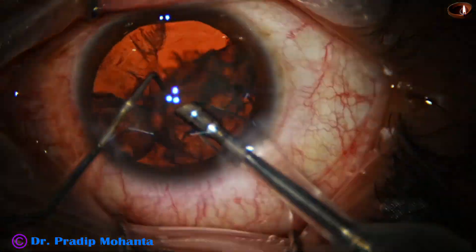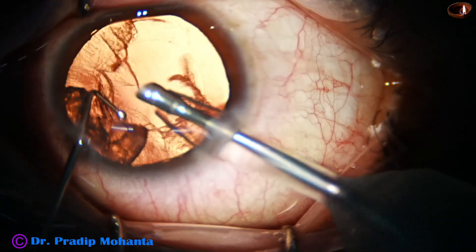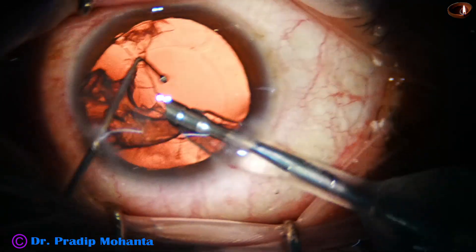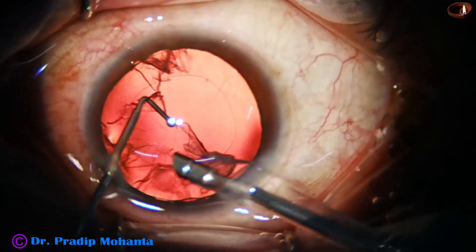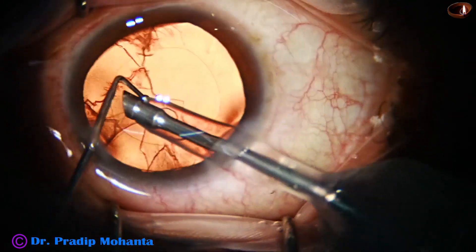This is the beauty of proper instruments for a given situation. Every cataract is different. We must customize a technique for that particular cataract — not one technique for all cataracts.